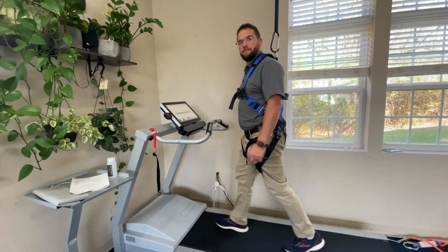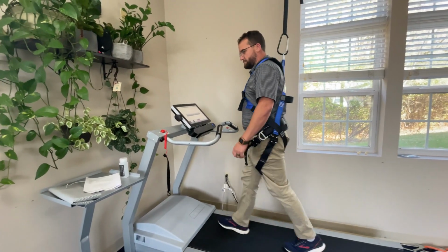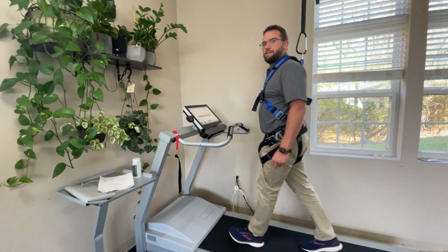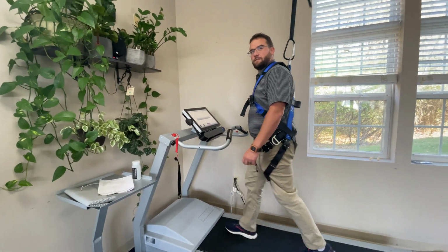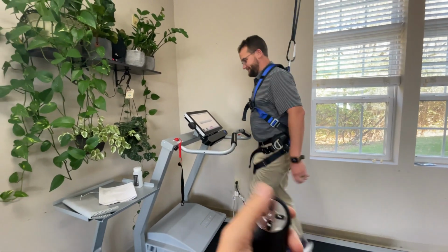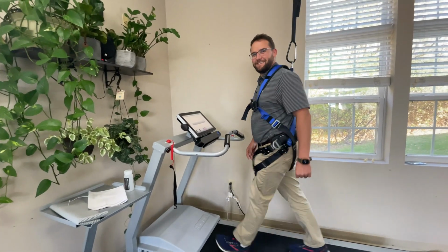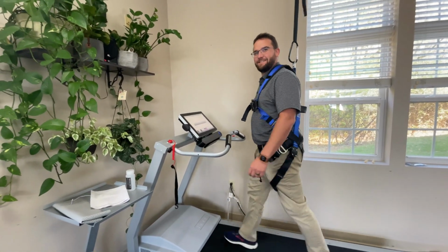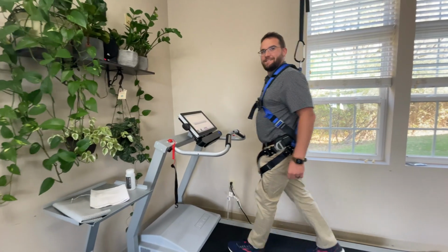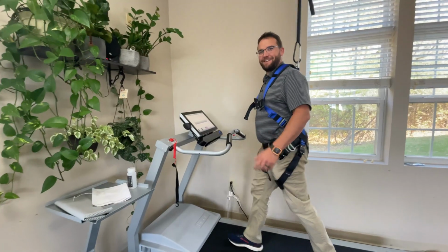And what I try to do from the therapist side is, I don't want to always do it at the 60-second mark or at the same time. I don't want to build a rhythm into it. I just want them walking, and then I'll go ahead and press it. And so I want that kind of startle response. I want them to react. I want to see how they feel. And we might be having a conversation about the weekend. And then again, I'm going to push it, and they're going to react.